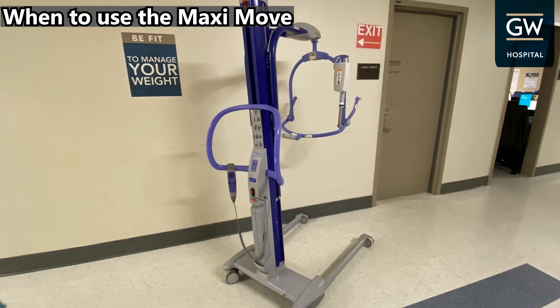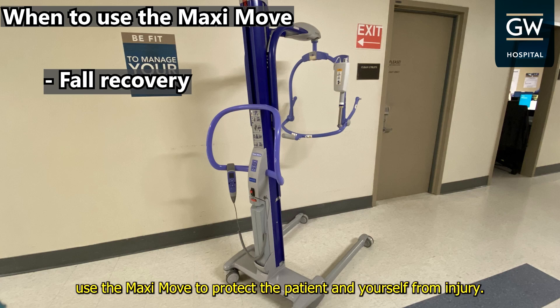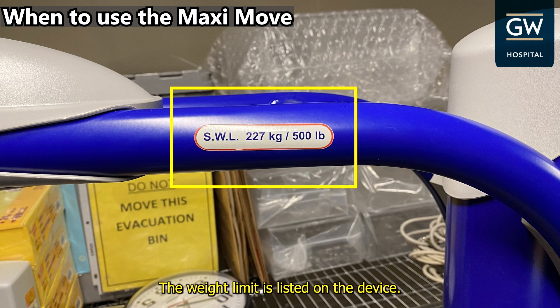When to use the MaxiMove. Fall recovery: if a patient is unable to stand up after a fall, use the MaxiMove to protect the patient and yourself from injury. Use the MaxiMove for patients who require maximum to total assistance for mobility. It has a weight limit of 500 pounds, which is listed on the device.